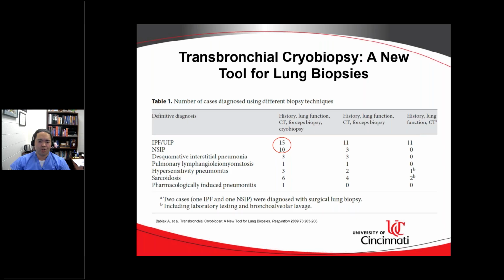With that, there was a growing interest in focusing on the diagnostic yield of cryobiopsies for interstitial lung disease, comparing it to surgical lung biopsy and seeing whether we could rival surgical lung biopsy as a gold standard in terms of diagnosis. But there were also descriptions of what happens if you don't have a pre-established protocol for transbronchial lung cryobiopsies. There's an interesting publication from the University of Pennsylvania in which all of these experienced IP attendings were doing cryobiopsy the best way they thought it would be, and they had some complications, and that sparked the discussion whether we need to standardize the technique or if anybody can actually do it.